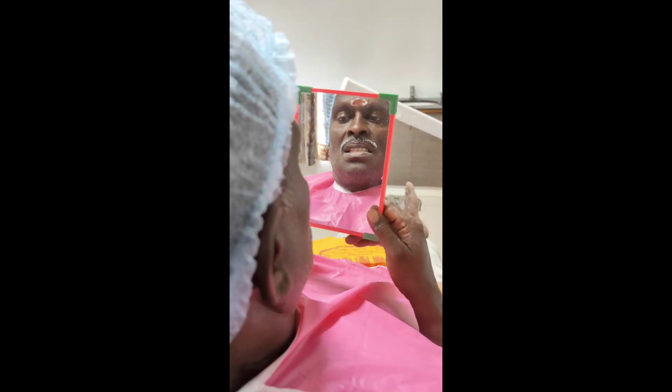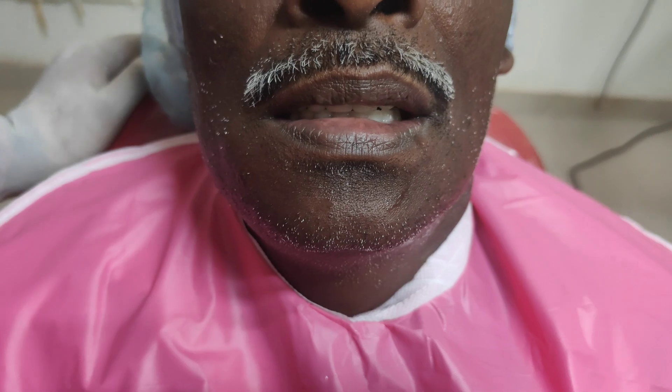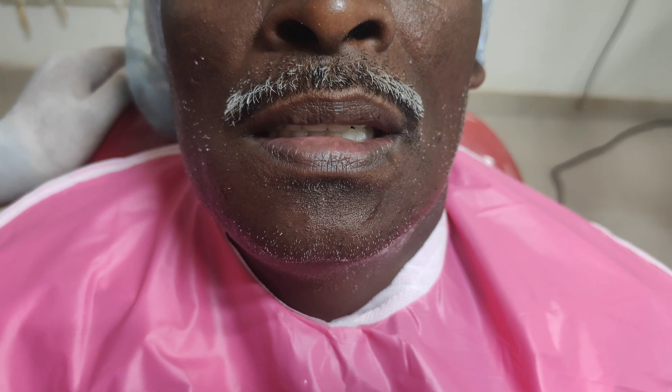The patient's opinion about the aesthetics of the denture is also important. A mirror is given to the patient and they are asked about their satisfaction regarding the denture appearance and smile. After this, phonetics must be checked by instructing the patient to produce all labiodental, linguodental, and bilabial sounds — such as counting from 1 to 10, saying words like 'fan' and 'van,' and pronouncing their name. There should not be any difficulty while pronouncing these words.